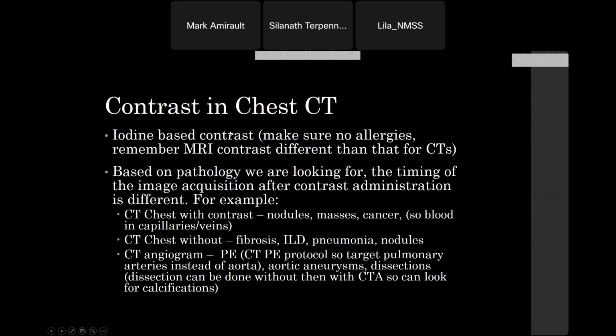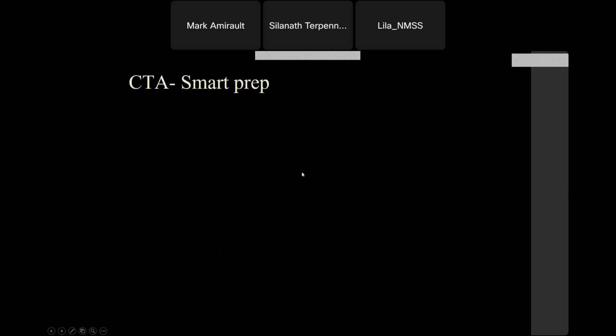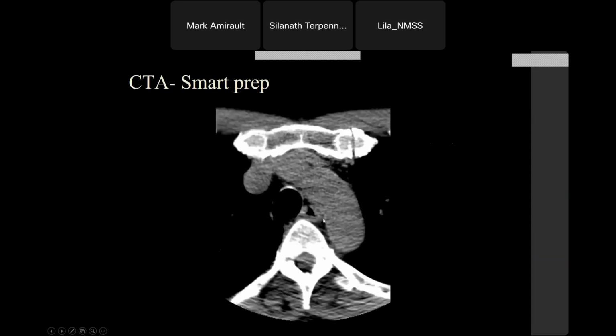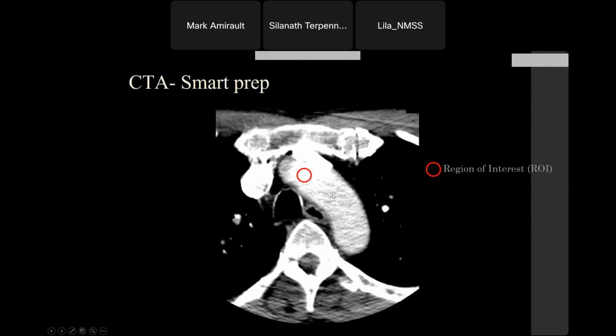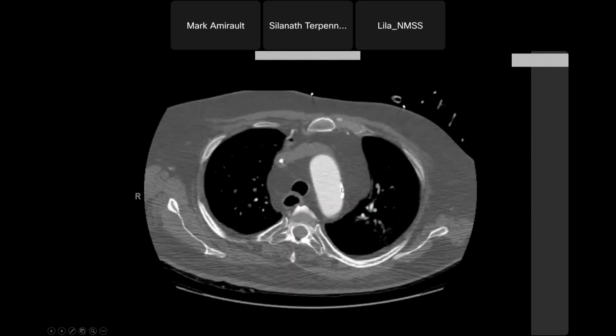Basically, we don't have to get into this too much, but obviously you want to make sure the patient isn't allergic to contrast whenever you're doing CTs. That's just something in the hospital that our staff always does. But we want to make sure there's good timing of our contrast. Machines are very smart. You can put a little field of interest here, and then when that lights up with contrast, the CT machine will take the images, and so you see this nicely acquired study.